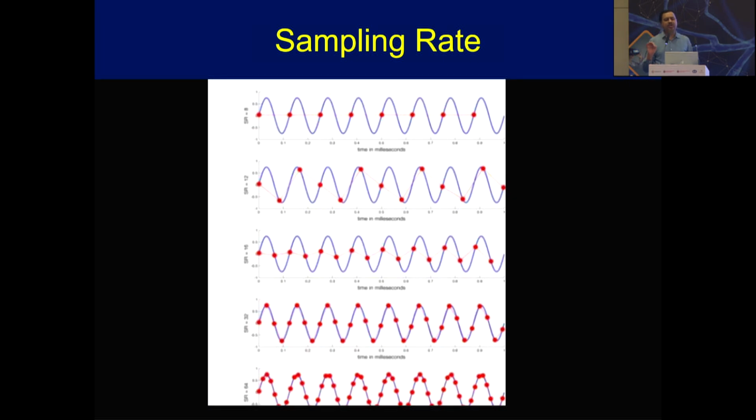Another important concept of the EEG machine which we have to understand when buying it is the sampling rate, because these analog signals have to be sampled at a particular frequency to convert them into a digital signal. This is physics; this is how these sinusoidal waveforms are sampled. You have this sinusoidal analog waveform. Suppose it is sampled at a frequency of 1 hertz, so in 1 second there is only one sample. You will have a sample here, here, and here. Finally, when you reconvert it, the computer will connect only these dots, and you will get a straight line.